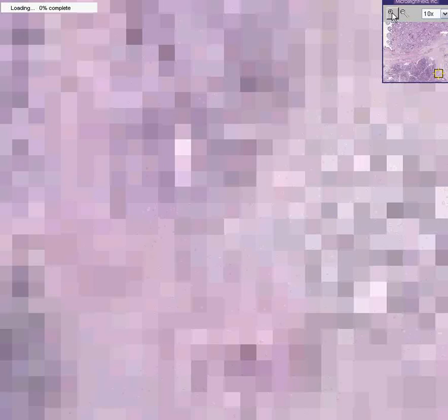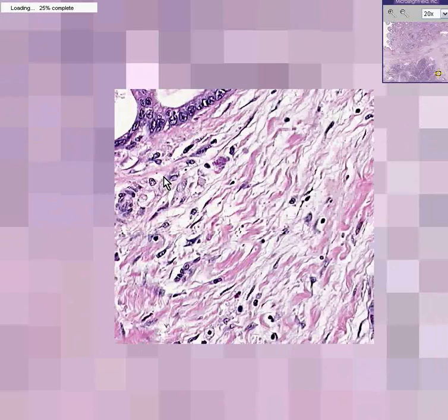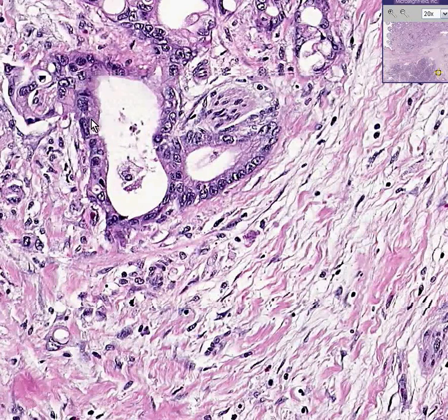Let's take one or two more closer looks at the malignant glands, however. You could see that for all the right reasons, they are very dark, they are very irregular, they are very invasive. Some of them are as glands, and some of them almost look like they're just individual cells. But in addition, here's something that you should notice as well. This group of glands or cells is surrounding an actual nerve, and you should not have any epithelial cells surrounding or encompassing or trapping nerves unless it's metastatic cancer. And that's exactly what we have here.